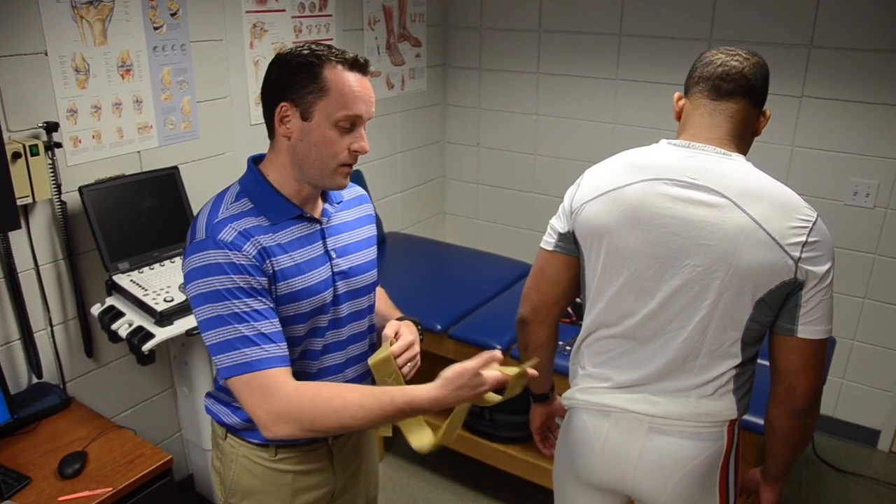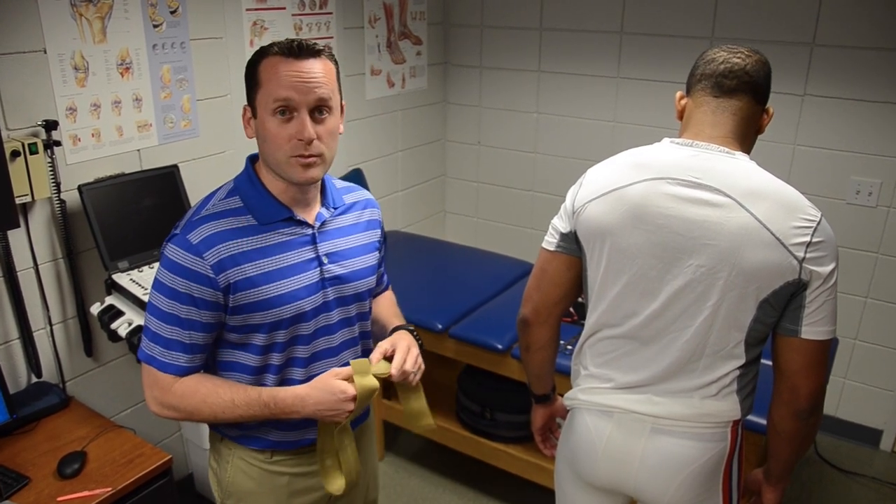Hi, I'm Paul Silvestri, the Associate Director of Sports Health here at the University of Florida, also the Head Athletic Trainer with the football team. Here to show you how to use the CLX TheraBand to add in an artificial hamstring.